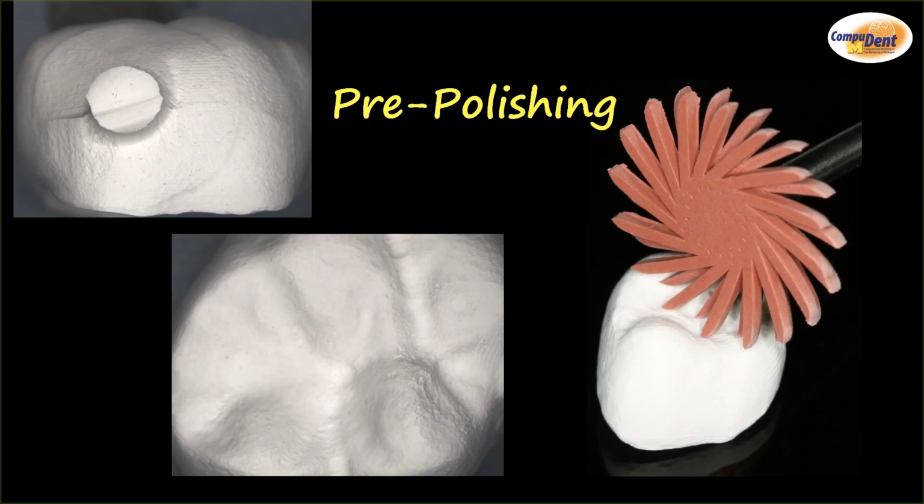One of the things people talk about is that polishing is so important for zirconia, and especially when you've got a short clinical crown, you're probably not going to take the time to do any kind of customization of color. So this is going to be a sintered polish process. We know in this green state before sintering, it's a much softer material, much easier to polish and handle. So some people advocate doing the bulk of the polishing in this state before sintering. That'll make it a little bit easier than doing all the polishing after it's been sintered.